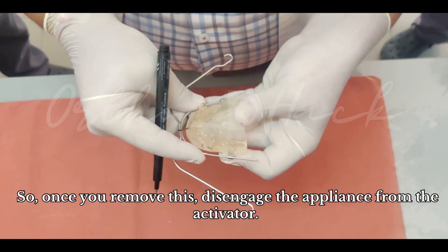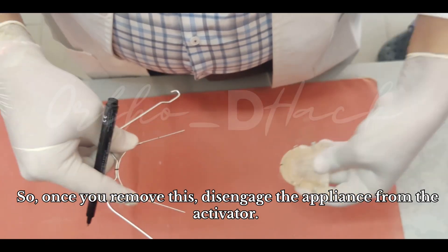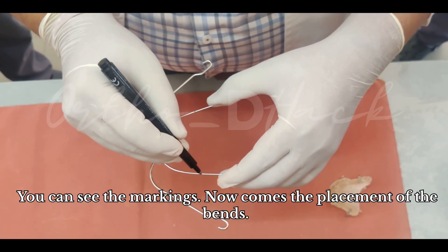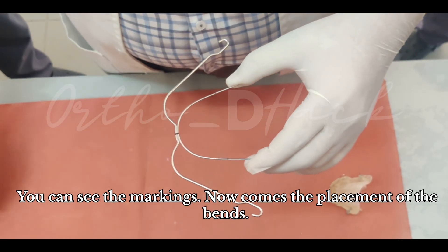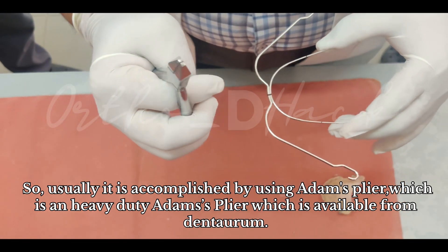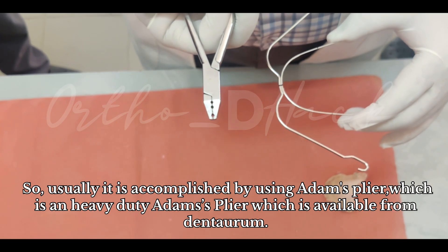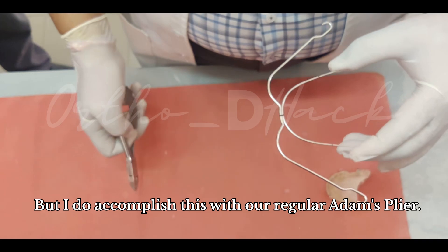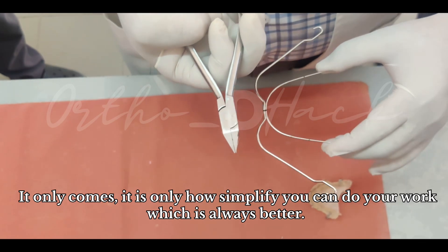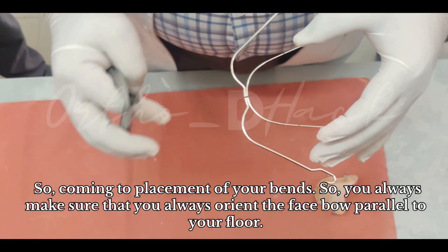Once you disengage the appliance from the activator, you can see the markings. Now comes the placement of the bends. This is usually accomplished using a heavy-duty Adams plier available from Dentaurum, but it can also be done with a regular Adams plier — simpler is always better. So, coming to the placement of your bends.